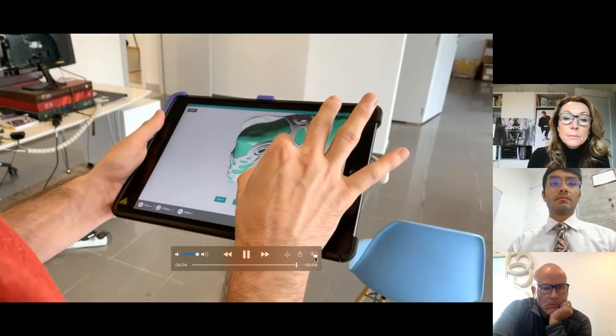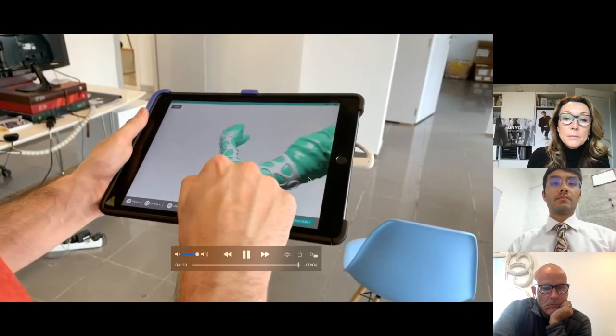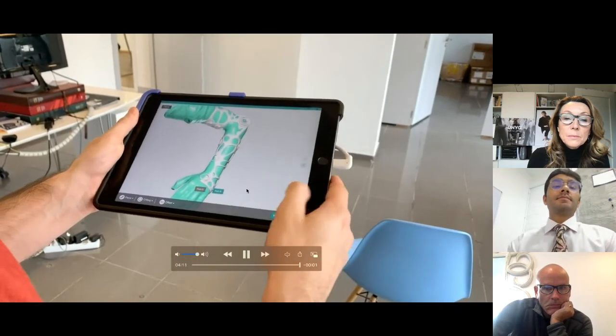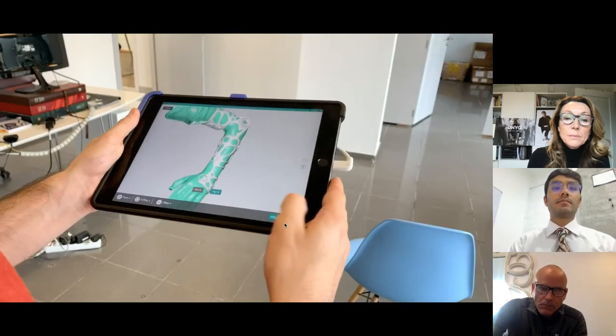I don't know if you're going to see it in this video, but we can change the parts. If you can see, everything is correct, and send to production, okay? It's that green button that you can see on the right. Okay, so this is the software process. It starts when you enter the patient's data here in the app, with the name, measurements, height, weight, where I come from, some little data.